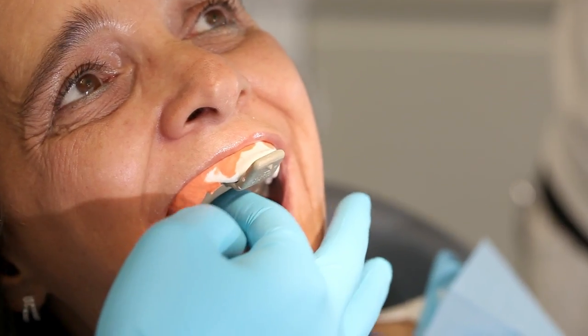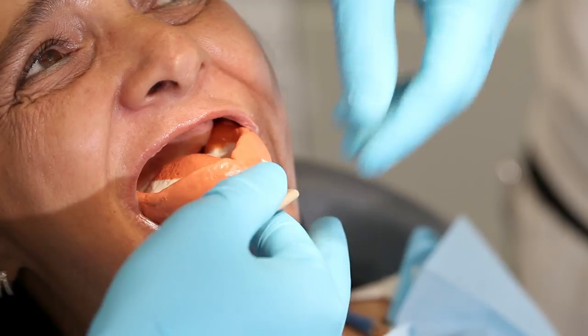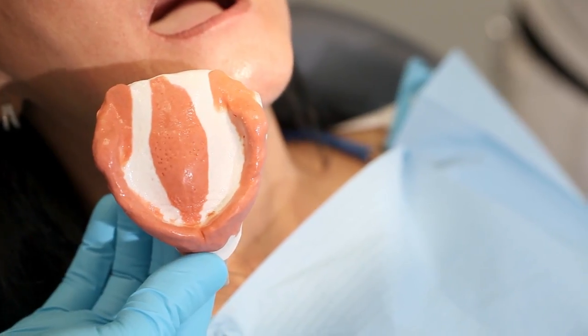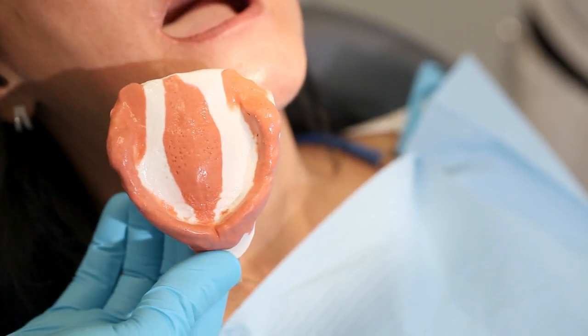Stop applying pressure to the tray but keep it in place until the material has set. Once the impression material has set, carefully remove the impression. Do not pull by the tray handle but break the vacuum with your index finger in the area of the tuberosity. This way you can detach the impression from the oral tissues. The finished impression should be free from air bubbles and all the important anatomical details should be visible.